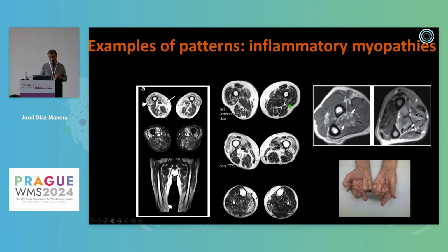And then it can also be useful to diagnose patients with IBM, and this is a patient where you see the typical involvement of the quadriceps that we see in clinics with a gradient from distal to proximal. This is a very nice image where you can see the coronal slice. The distal section of the quadriceps is gone, while the proximal is still fine. But because this is an inflammatory myopathy, the STIR is very increased. So when you see an increase in STIR, think about inflammatory myopathies, but take into account that in some muscular dystrophies like FSHD, dysferlin, you can also have an increased STIR signal.